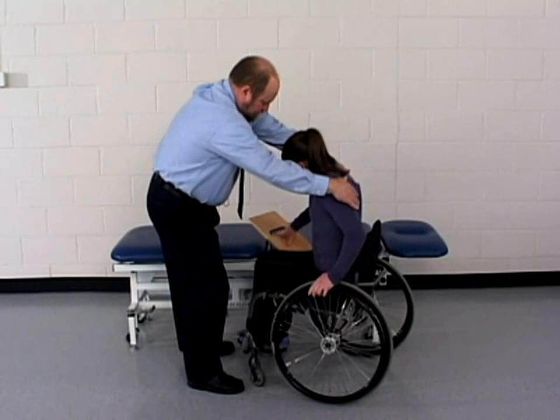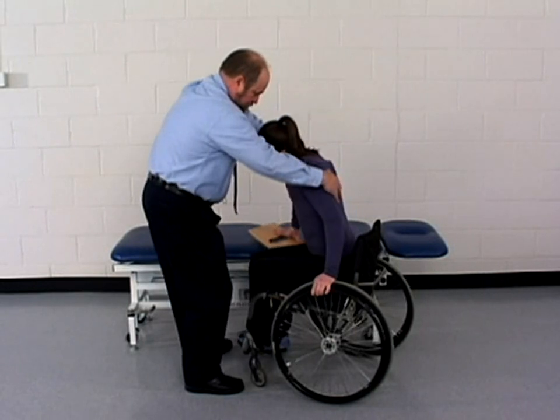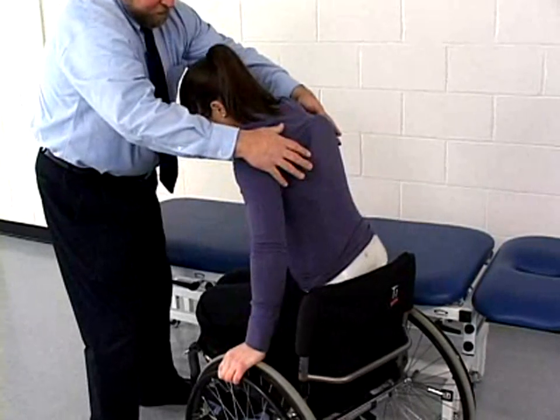The physical therapist guards the patient by standing in front of her. The therapist is then in a position to also provide assistance in lifting as the patient does a sitting push-up. The therapist can also assist with the patient's balance by placing his hands on the patient's shoulders.